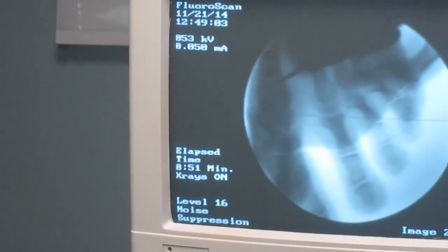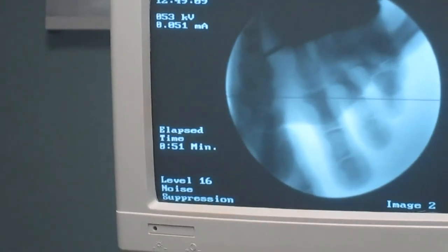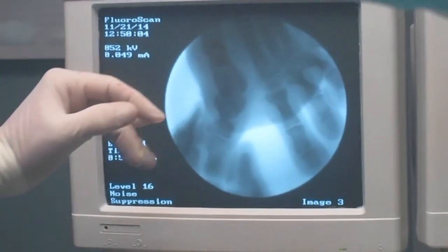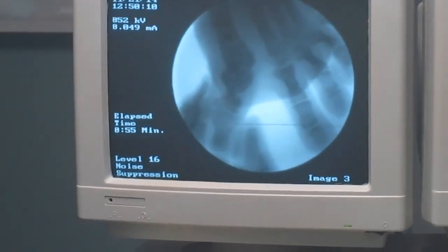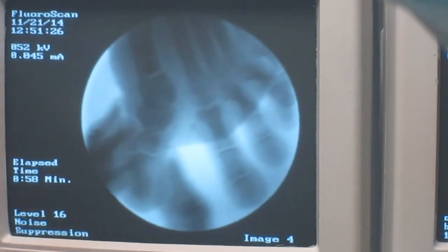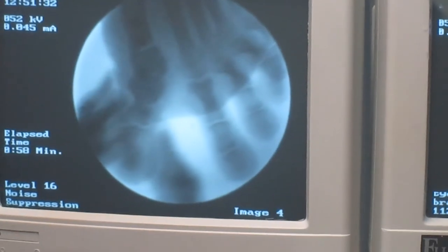So we're gonna go from about this area and we'll end up behind the sesamoids, more in the dorsal aspect. So we're gonna take a wedge out to place this bone more laterally. Cut through the metatarsal. I'm going to now take a wedge out and push the metatarsal head over this way. I distracted that out so you could see what we're doing with the metatarsal. Our medial cortex is intact. We've done this just in front of our fixation so that when we green stick this over, this is going to give us a little better angle and a better pull of our tendons here.